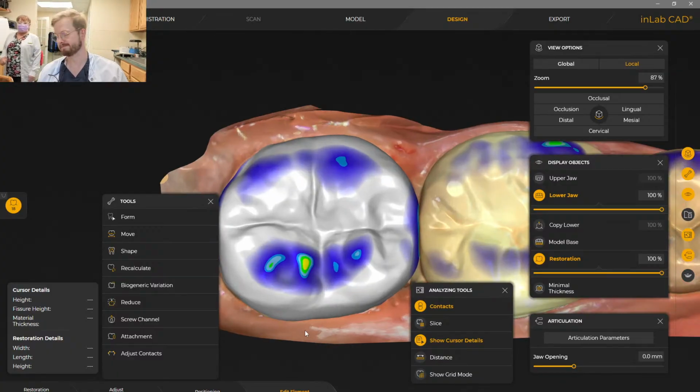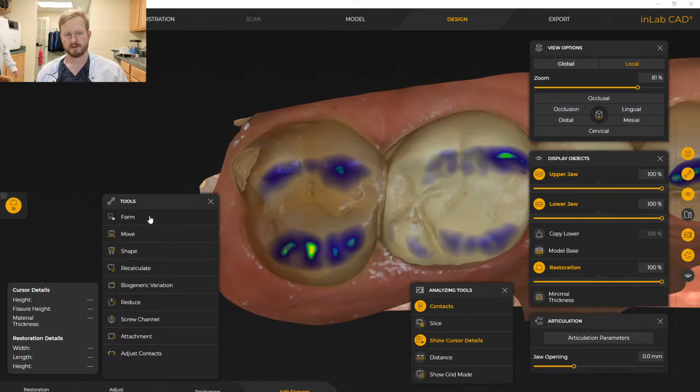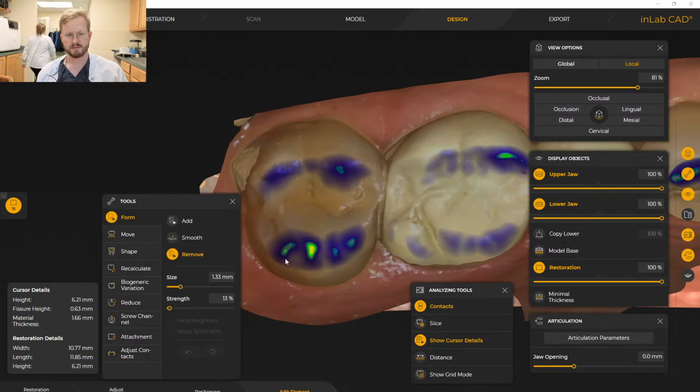Bond this. What's up? I was just getting ready to see when I can do my crown. Yeah, we're getting there. Okay.